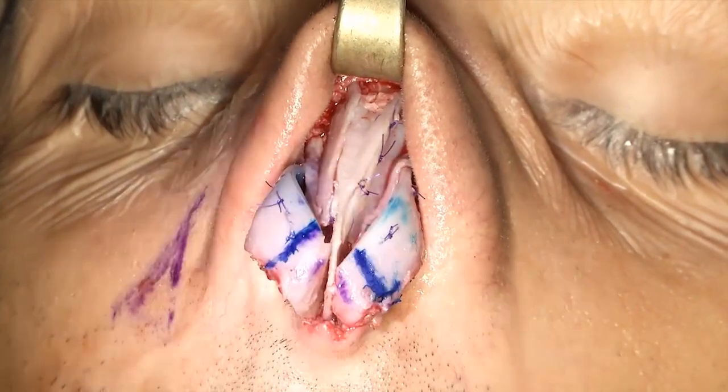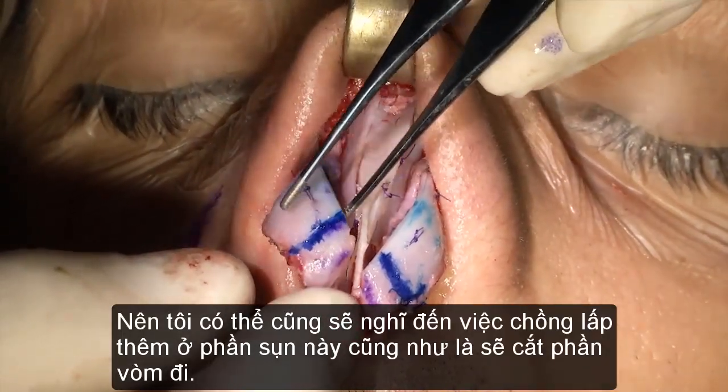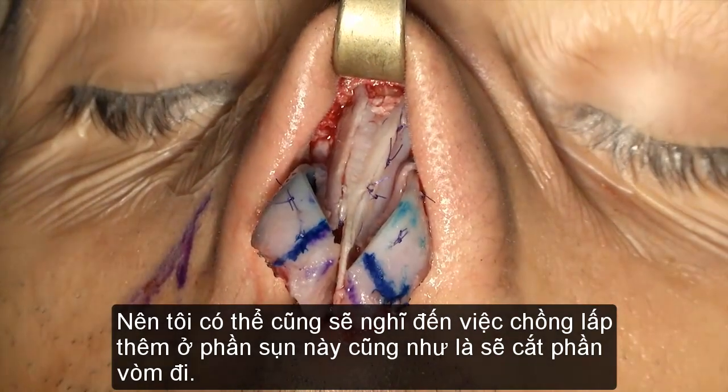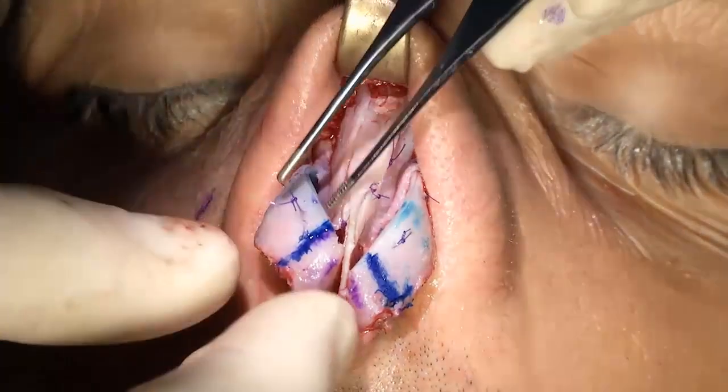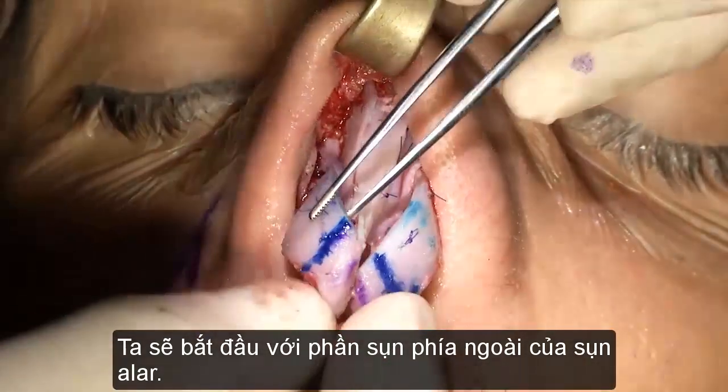So, I could also think of overlapping them, but by cutting the domes as well. But let's start with this lateral crus steal thing.